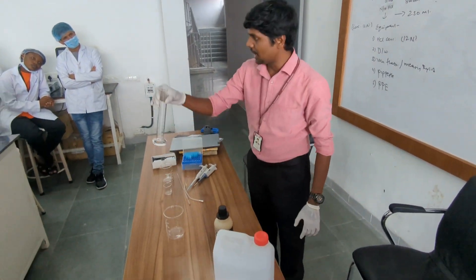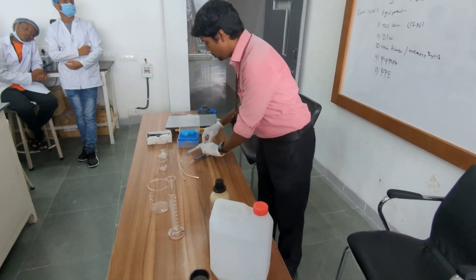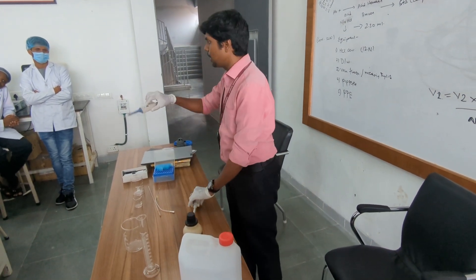For this we have a 100 ml measuring cylinder and a beaker. I also have two micropipettes — one is 1000 microlitres, that means 1 ml, and the other is a 50 microlitre pipette.